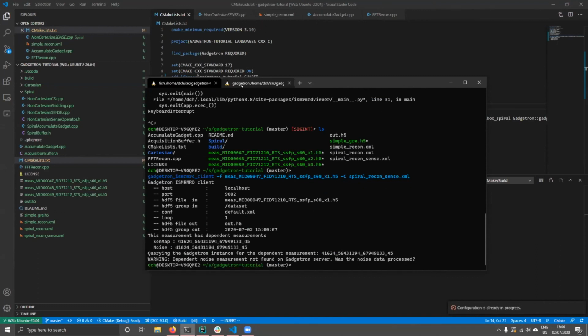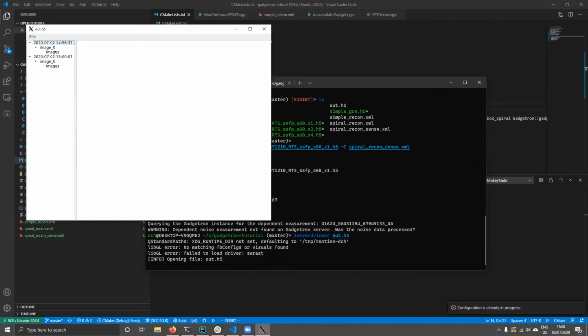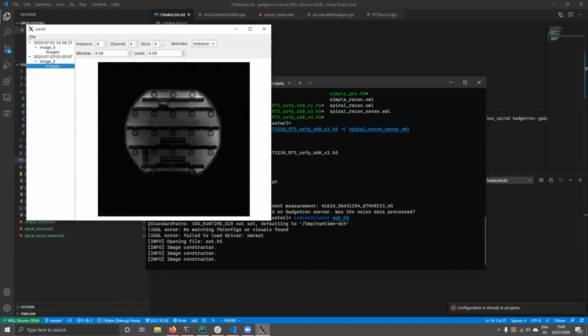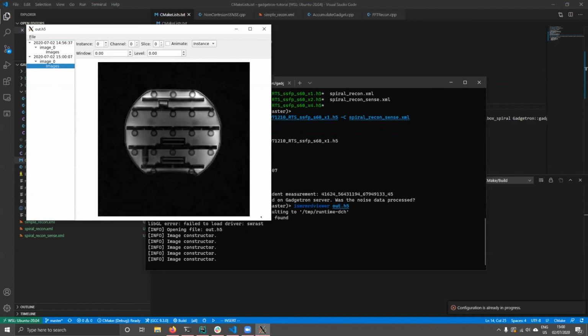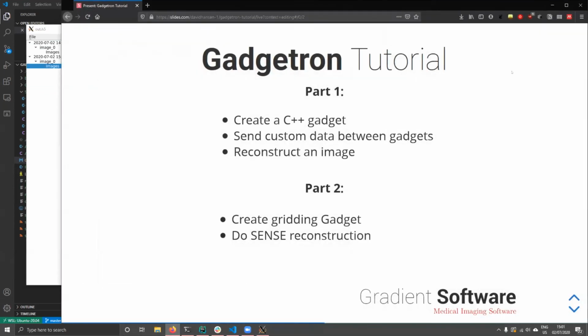He says, and then he has to wait. Oh, it's done. So we can open the data. You can see we have the old image here and the new image, and they look completely the same. Yeah, maybe the SENSE one is a little bit sharper. Well, this is a fully sampled data set, so you wouldn't expect the difference to be enormous, but that's how you would do it. And that is me almost out of time.